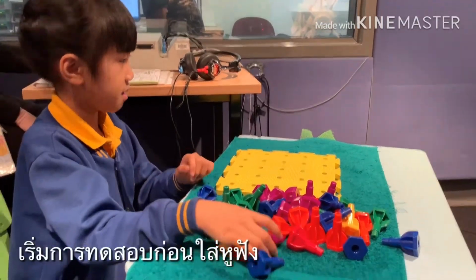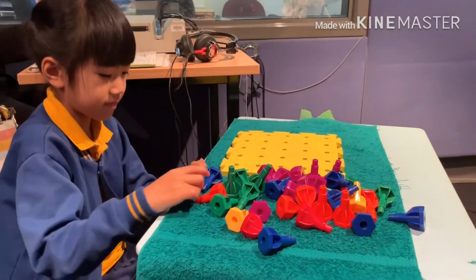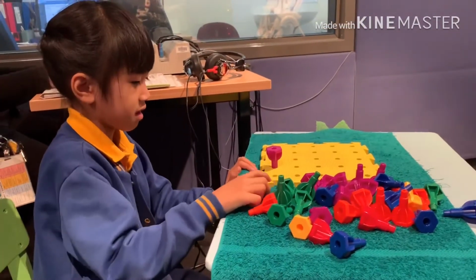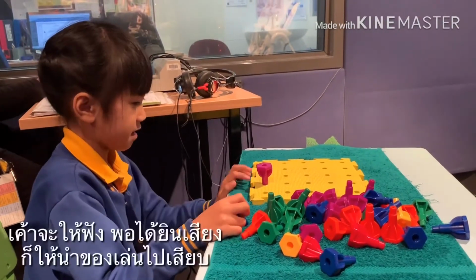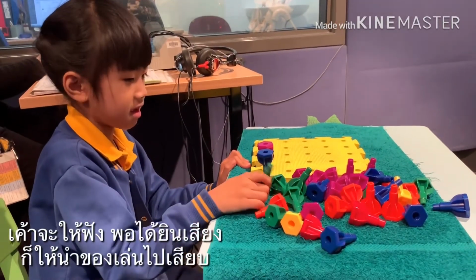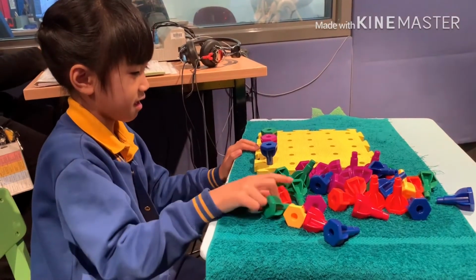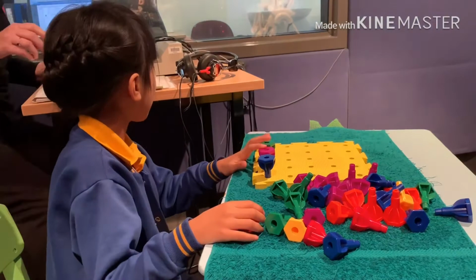Alright, so we're going to practice before we put the headphones on so you can do it. Okay, ready? Good girl. See, did it stop? Okay. Very good. She's very quick. Oh, such a quick one. Right, we can do it with the headphones now. Headphones.